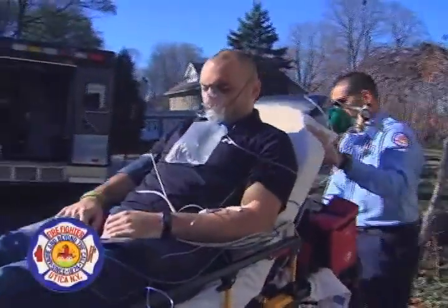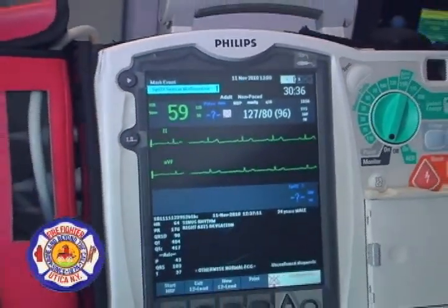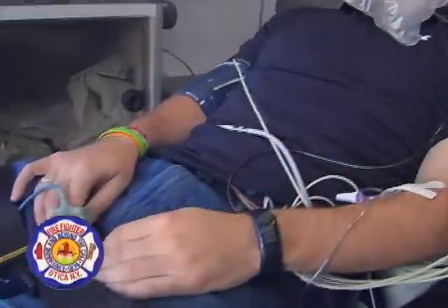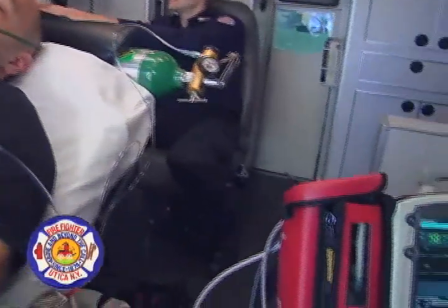Paramedics respond to a call if they determine that an EKG is necessary. They'll take the EKG, and once it's been captured, they send it to the laptop via Bluetooth. The software is designed to go from ambulance computer to hospital CAREpoint. Now, St. E's has a hospital CAREpoint. It's designed to import from the cardiac monitor, and once it's been imported, to go directly to the hospital CAREpoint. And once it's been imported, it only takes a matter of seconds for the EKG to get to its destination.